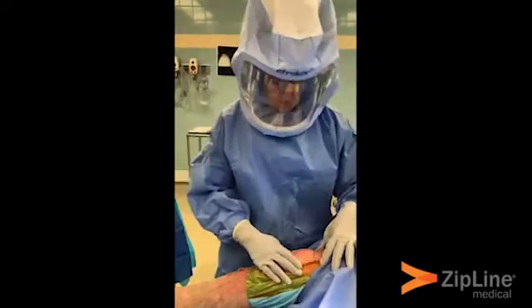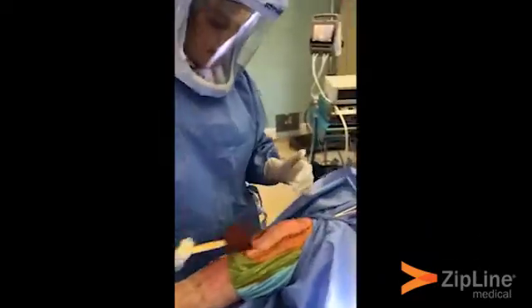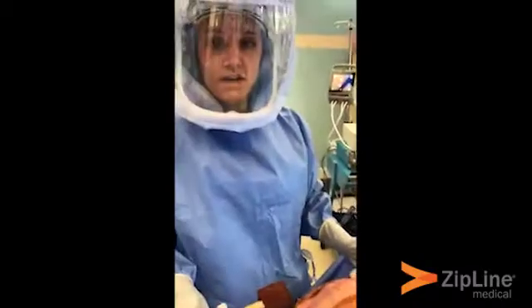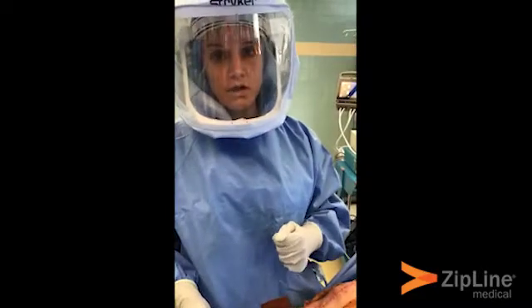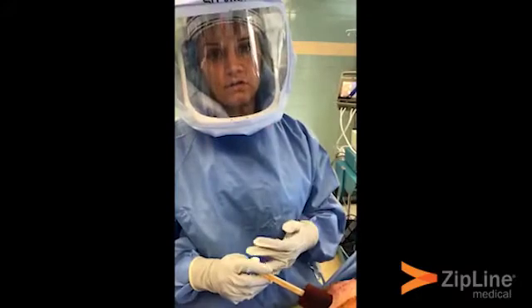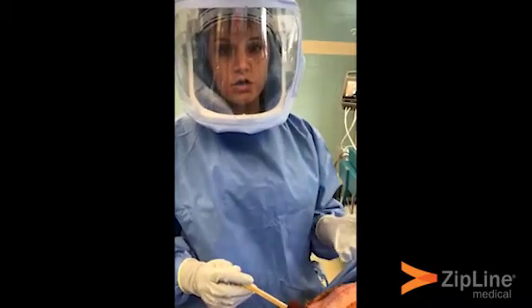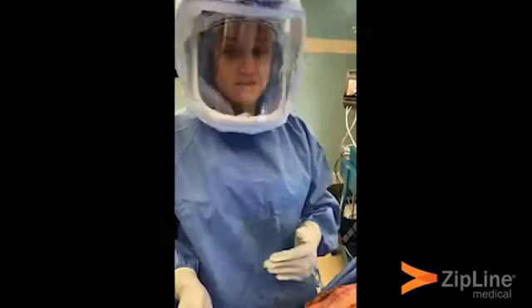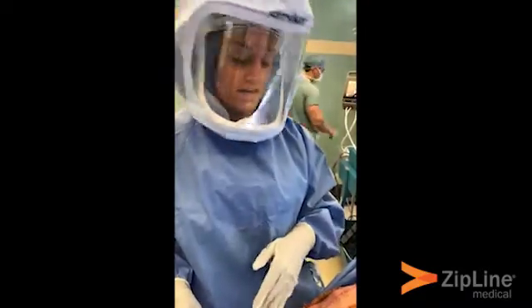First, I just closed the subcutaneous layer, and now the part of the closure I'm at is the subcuticular. At this point the PA or the surgeon would either close with staples, a fine subcuticular suture, and then typically a glue-based product — but instead we're going to be using the Zipline product.